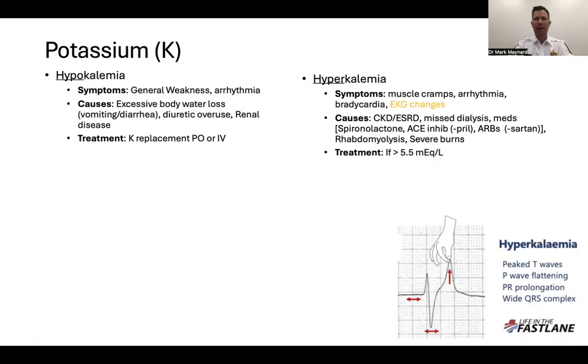All right, so how high is too high? Well, if it's above 5.5, then we can consider treatment. All right, so what is the treatment? Well, it kind of depends. If the patient is in cardiac arrest and we get back a high value, we're going to follow the hyperkalemia protocol.